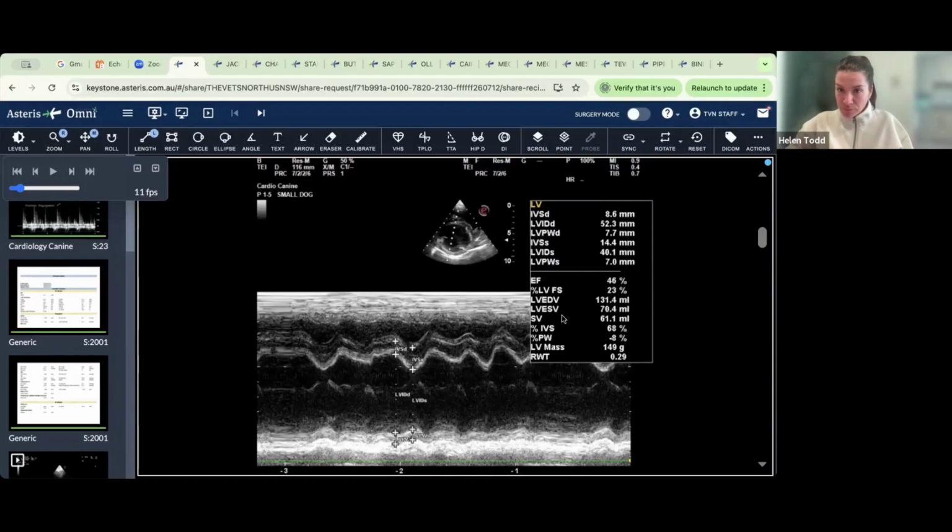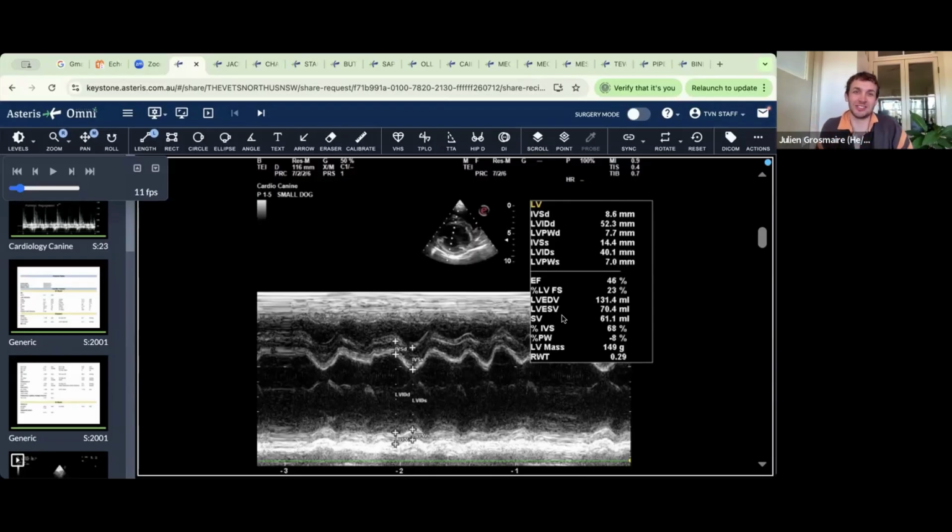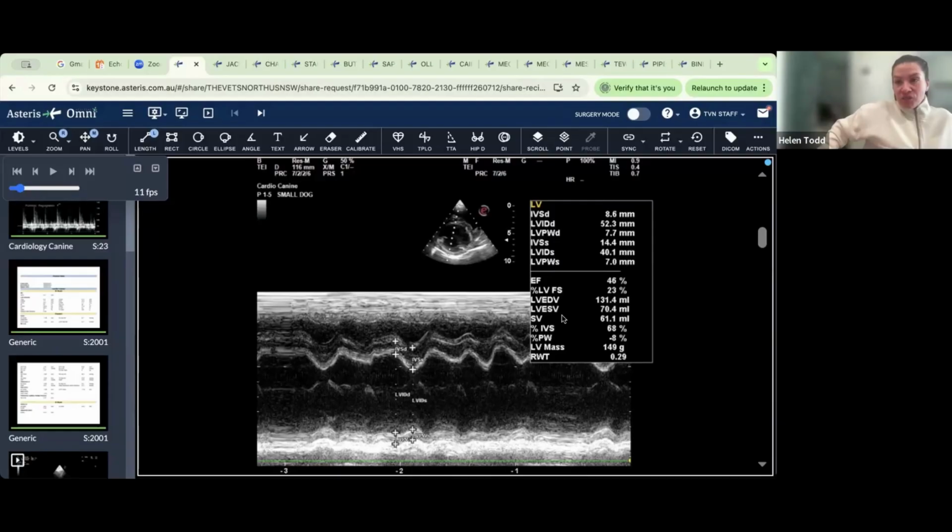This patient. How far out, like if it's 1% out, can you just say that that's probably operator error? How far out do you? When I started doing this, I would do this several times. So I would do like 4 or 5 of these, and I still do sometimes, and then take an average.